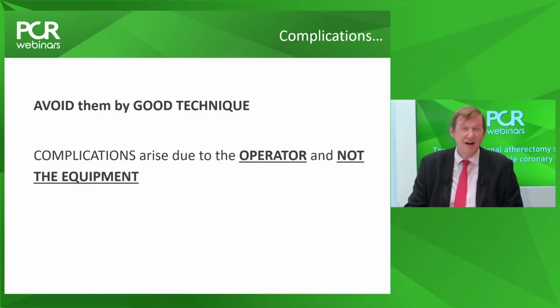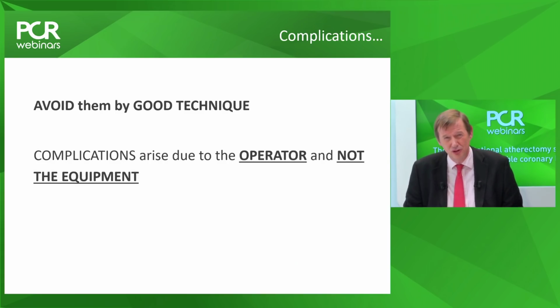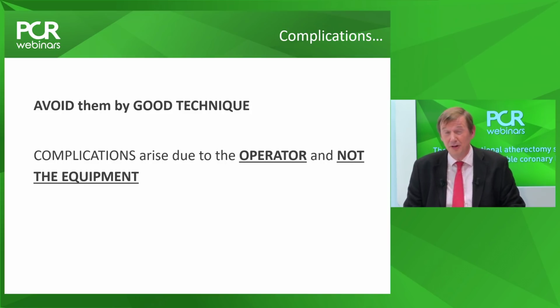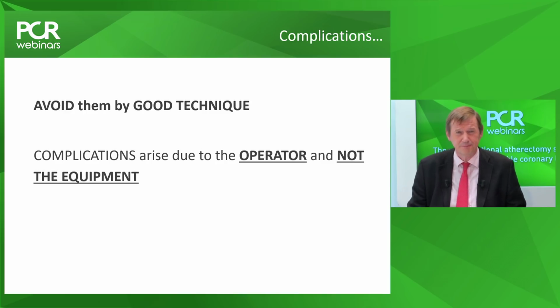So overall, from the complication session, avoid them by doing rotational atherectomy with good technique. If you're not as experienced as you'd like to be, try and do it with an experienced operator and get more confidence with the device. My experience is that the complications are nearly always due to decision making and the operator, and it's rarely a problem with the equipment.